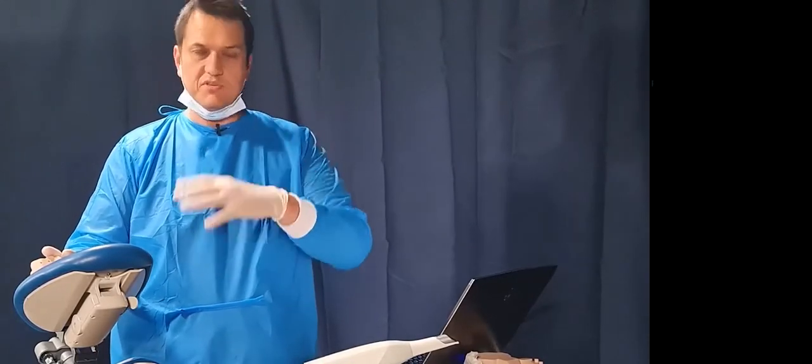Now I'm going to swap out my mannequin for a real live patient who has the same indication as this. Well, it's going to be on the upper opposing. It's hard to find patients these days. So let's swap out our articulator now for a real live patient with our missing tooth. Mr. Patient, if you can jump in now, that'd be great. Yep.